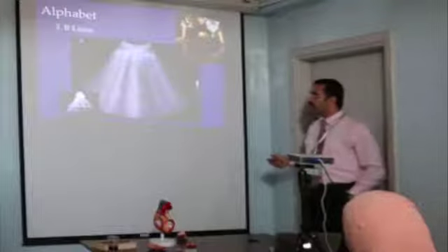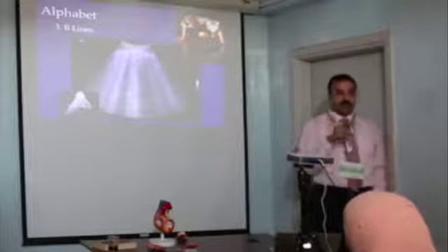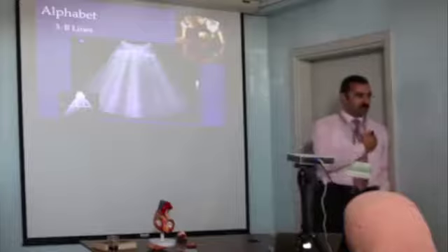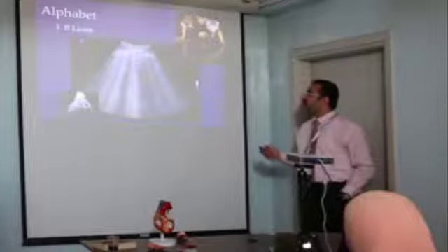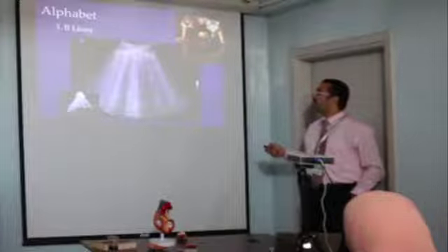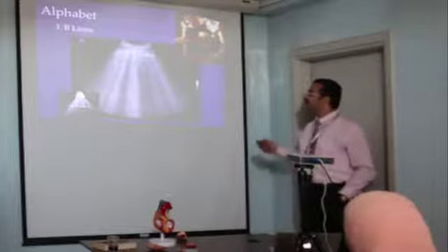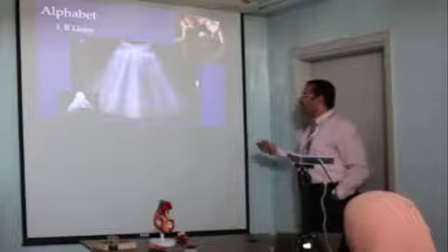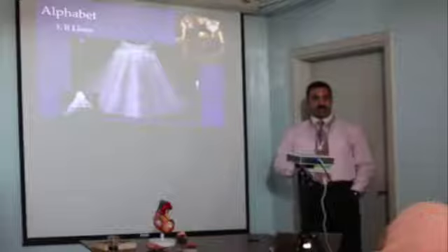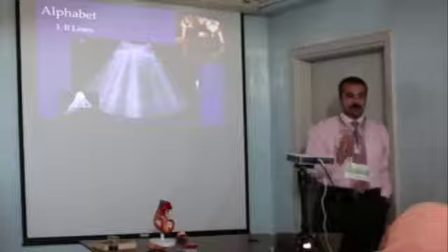It's the ultrasound waves passing in the interalveolar septi, which contain some fluids, even normally. As interstitium, we have some fluids, isn't it? So reflection of the ultrasound waves in the interalveolar septa is different from the air. That makes these B lines. It starts from the pleura till the end of your ultrasound sector. Normal is 1 to 2 lines. If more than this, it's diagnostic of fluid in the interstitium.